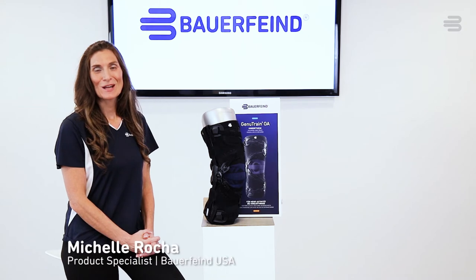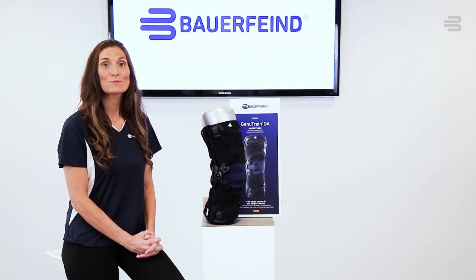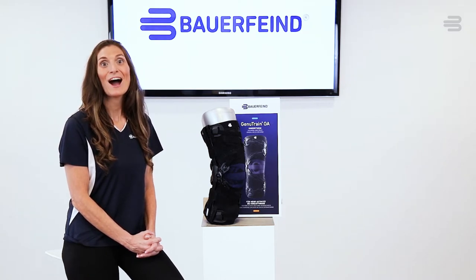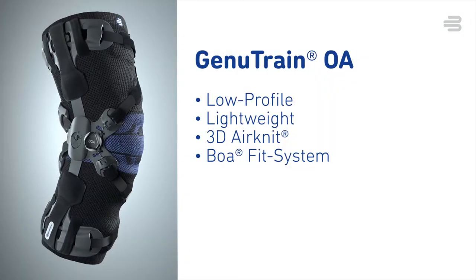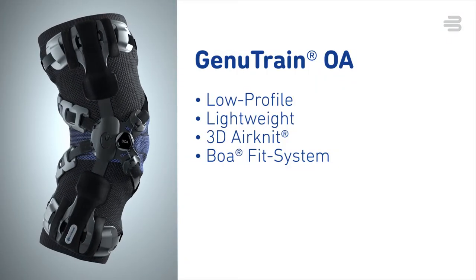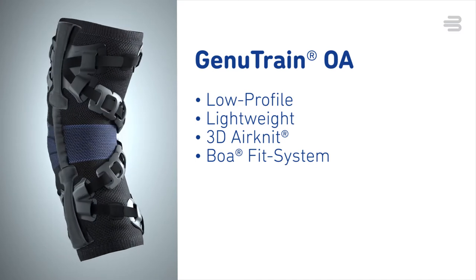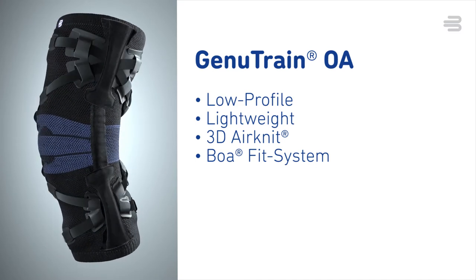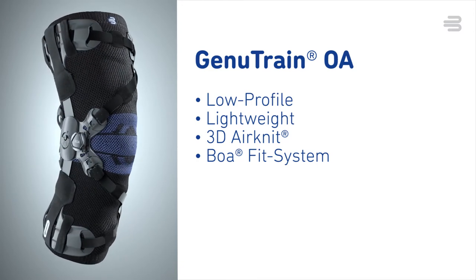Hi, I'm Michelle Rocha, the Bauerfeind Product Specialist. Your healthcare provider has prescribed you the GenuTrain OA, a high-quality unloading brace that is designed to reduce knee pain and provide relief to help you maintain your daily activities. The low-profile and lightweight design combined with high-tech materials such as the compression Airknit and a unique BOA Fit system makes this innovative brace very comfortable to wear and easy to use while still providing effective pain relief.